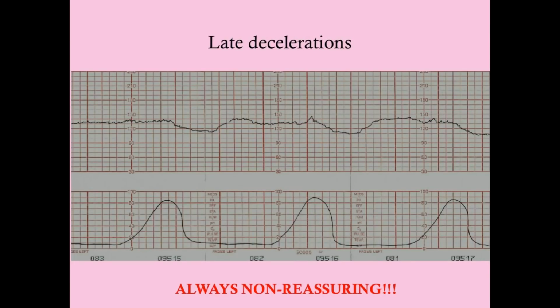So this is a late deceleration. Now, one of the things that's going to help you differentiate a late deceleration from a variable deceleration is how gradual a late deceleration is, first of all. Okay, very gradual. It's not an abrupt drop. Okay, from onset to nadir is much more than 30 seconds. But also how shallow it is. You don't have a real significant drop in heart rate. So baseline here, about 135, dropping to about 115. Okay, only a drop of about 20 beats per minute. Very rarely do late decelerations drop more than 30 beats per minute. Usually it's around 5 to 30 beats per minute. And they're very long and they're very shallow. Okay, so they look like early decelerations. They don't look at all like variable decelerations.